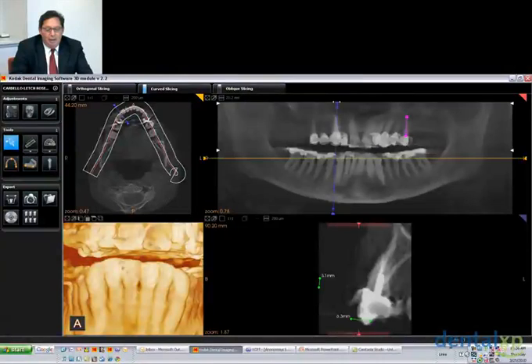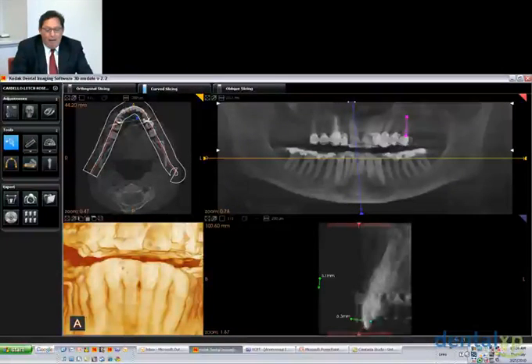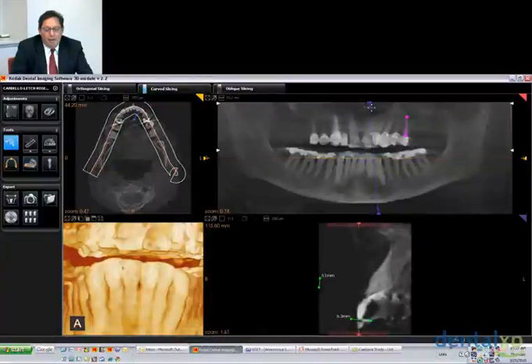And I think it's a testimony really to this Kodak software, because I'm able to do this on the fly right in front of the patient. My objective, of course, is to get that adrenaline pump off. My other objective is to do this. As I roll through the mouth, I'm going to find things. And when I find things, I'm going to document them.